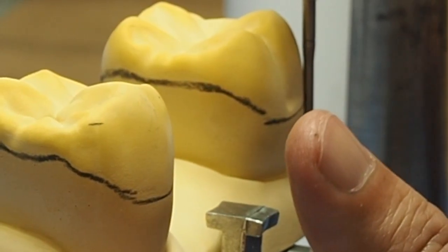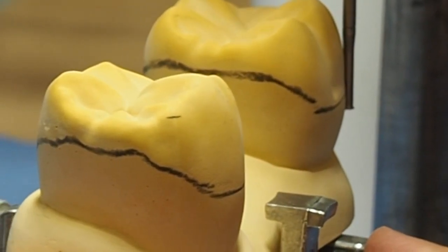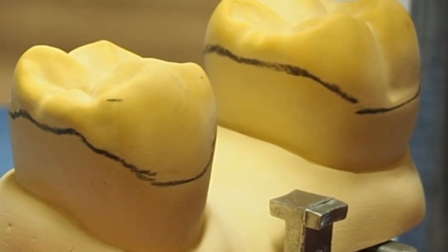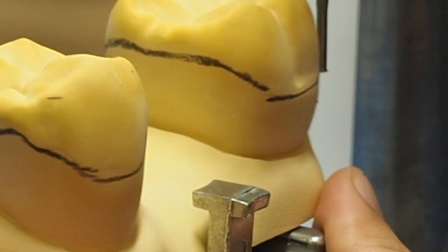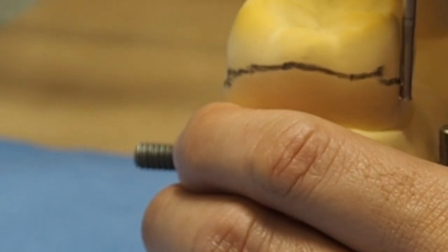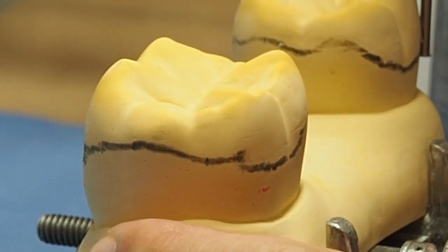Do you remember the assignment? Which undercuts is it? Buccal? The mesial buccal on the molar and distal buccal on the molar, okay. Mesial buccal on the bicuspid. So he would look where that is. Here's colored pencils if you want them. Unless he's changing, he was marking it in red, which I used to do, where that undercut gauge touches the tooth. And on the diagnostic one, he can actually scratch it a little bit. You don't scratch it on the final master model that you're sending in for processing.